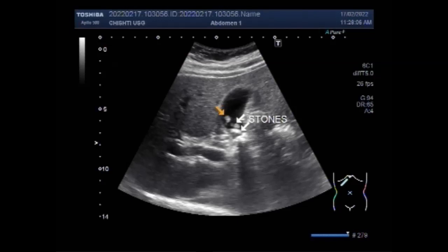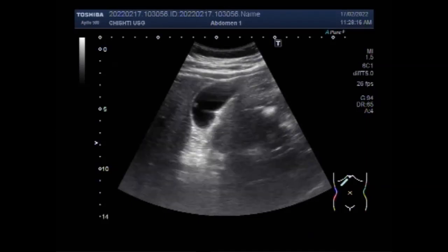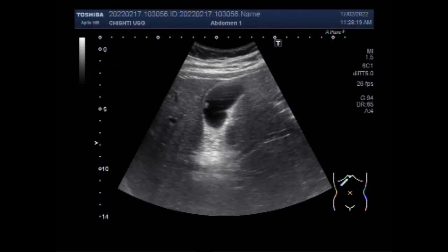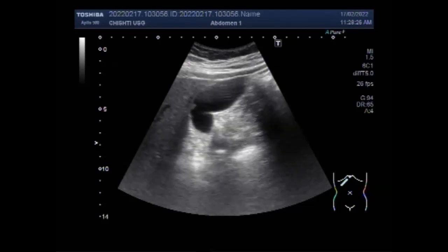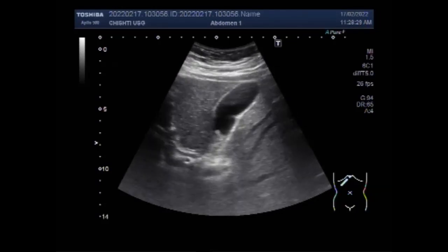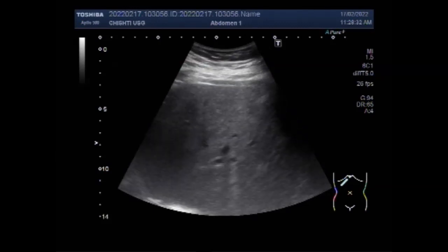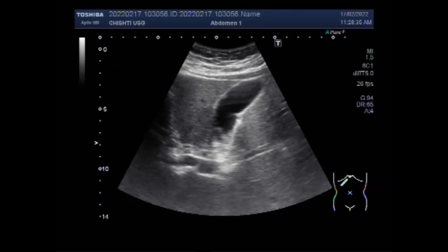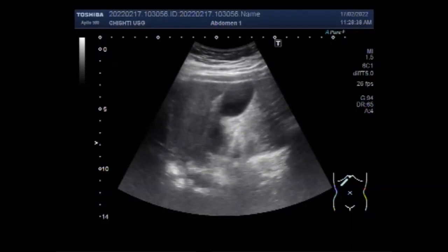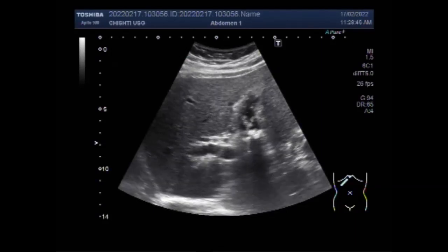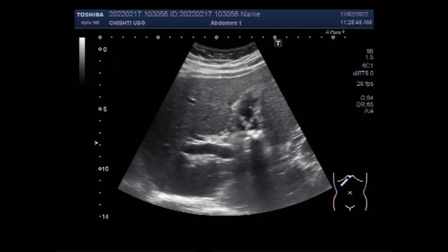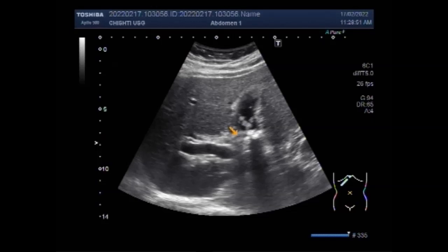Now, thickening of the gallbladder wall is a relatively frequent finding at diagnostic imaging studies. Historically, a thick-walled gallbladder has been regarded as proof of primary gallbladder disease and is a well-known hallmark feature of acute cholecystitis. The normal gallbladder wall thickness is usually less than 3 mm, provided that the patient has been fasting for 8 to 12 hours. Visualization of the normal gallbladder should be nearly complete, and non-visualization of the gallbladder is a pathological finding in 96% of cases involving truly fasting patients. Gallbladder thickening may be caused by repeated attacks of acute cholecystitis.